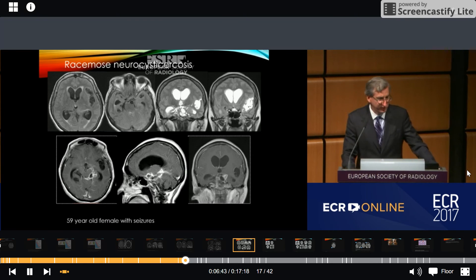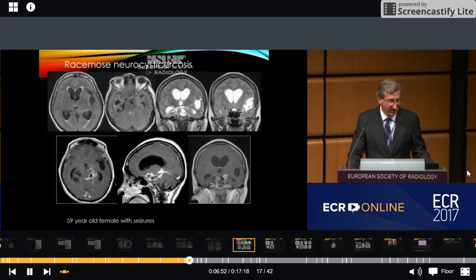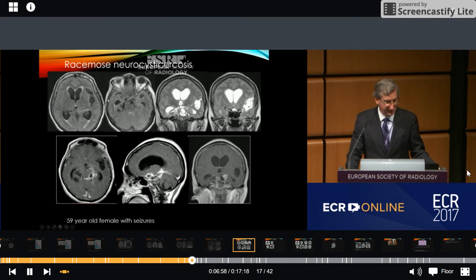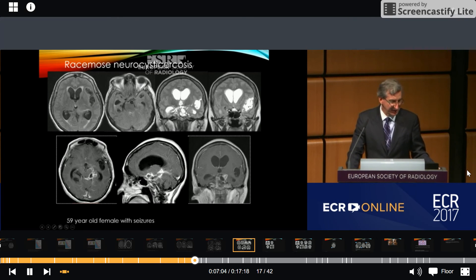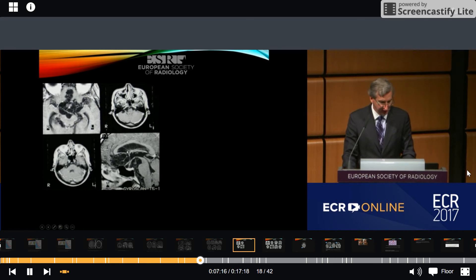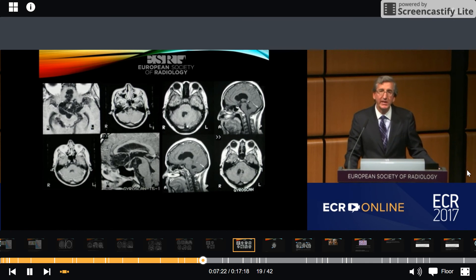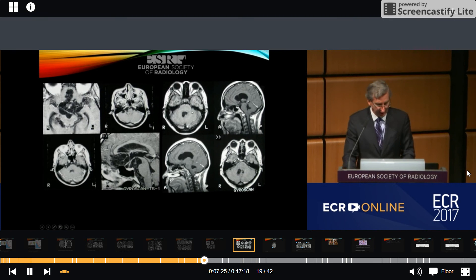This is a case from my own experience where we can see the racemose variety of neurocysticercosis. This was a 59-year-old female with seizures. We can see multiple cystic lesions in the basal cisterns and in the Sylvian fissure; some of them show ring enhancement and produce hydrocephalus. This is another example of racemose neurocysticercosis where the cyst is located in the basal cisterns. And here is one more case where we can see a single cyst located in the fourth ventricle producing hydrocephalus.